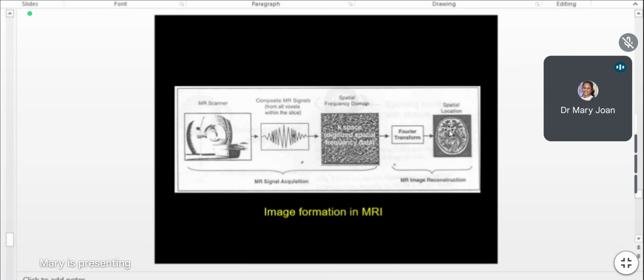We can visually understand it. Whatever densities are there, in whichever direction, however much relaxation and recovery happened, all of these are stored in the K space. So using the Fourier transform, we convert it into an image which can be understood by us.